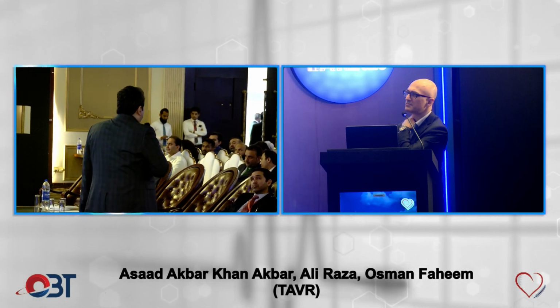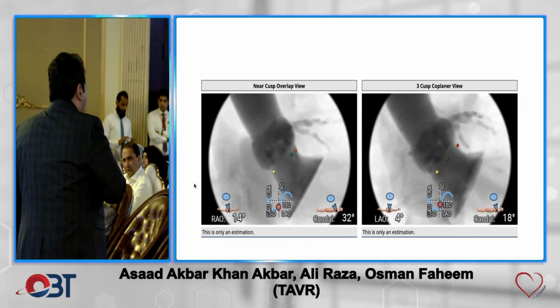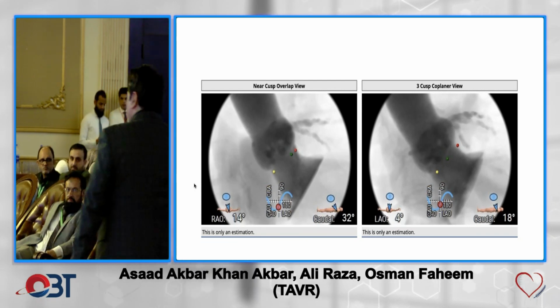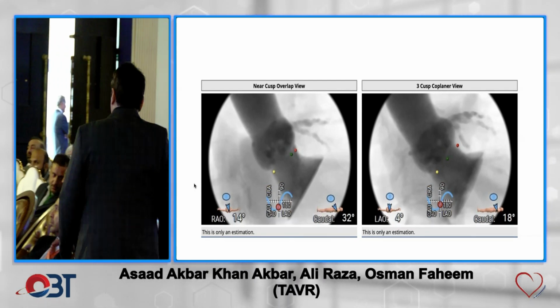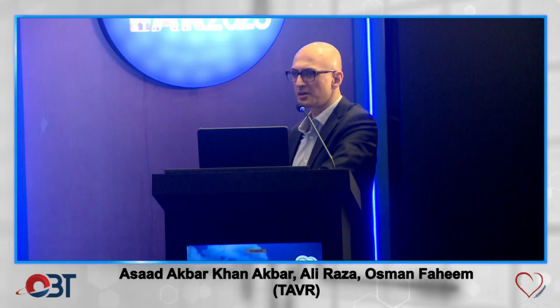It never becomes circular. It will never take the shape of the annulus or the measurements of the annulus. I don't know what the other people's opinion about it is. Yeah, especially for self-expanding. The balloon expandable, you can kind of force it to conform to a circular orifice.